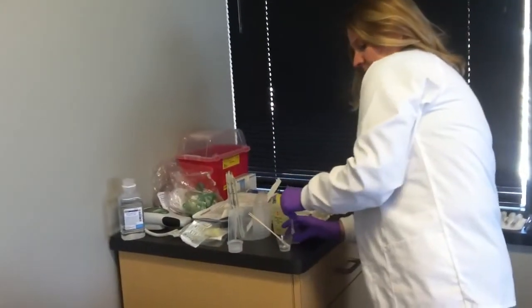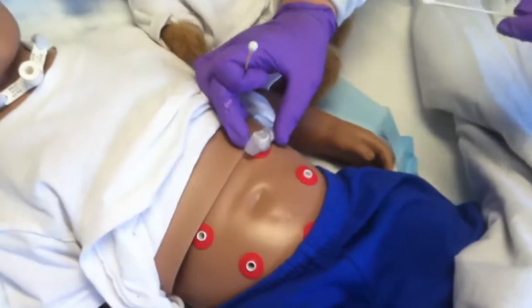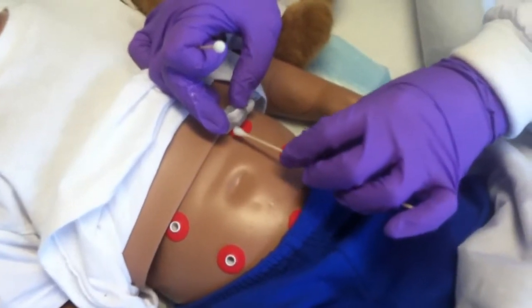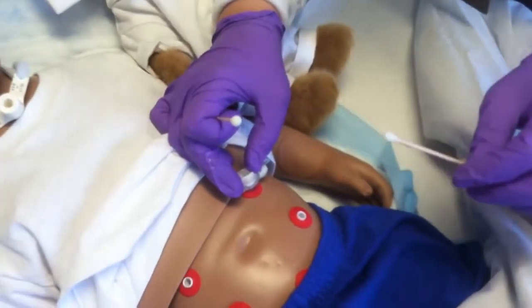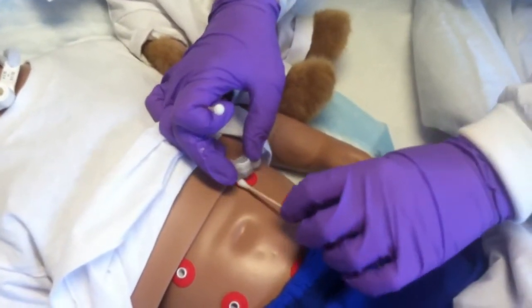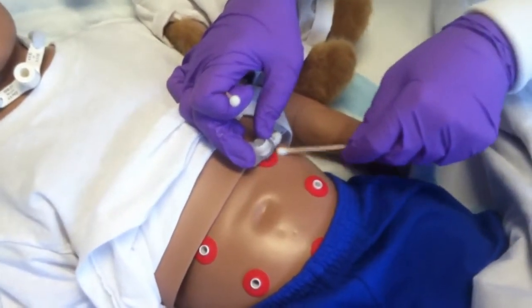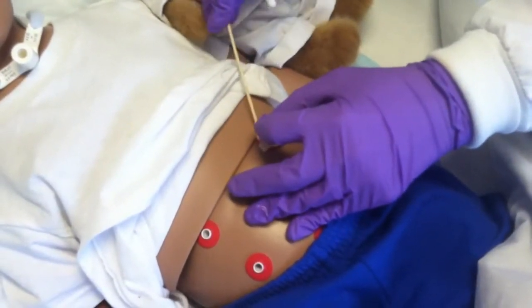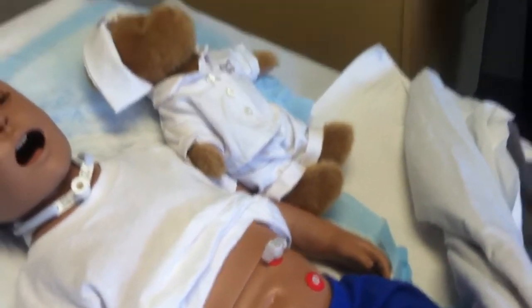Okay, so then you're going to start with the soapy water. You'll have 2 Q-tips, 1 for the top half, 1 for the bottom half. So we'll start on the bottom half, and you tilt the G-tube up, and then you twirl. I don't know if you can see me twirling, but we don't scrub back and forth on a fresh G-tube site or a site that looks like there's problems with it. We have to be real gentle. So we would just twirl it and rotate it. You want to get it right up next to that tube that's going in there, okay? And then you'll take the other clean one and do the top half by twirling and rotating it, okay?